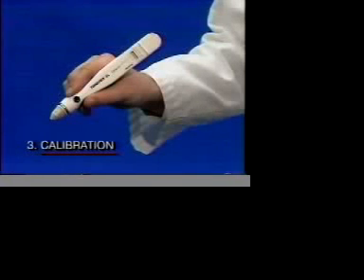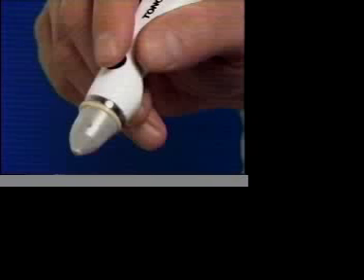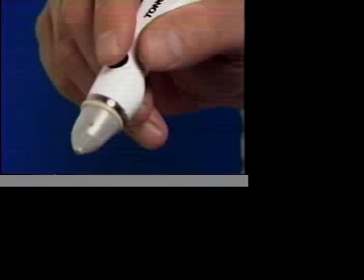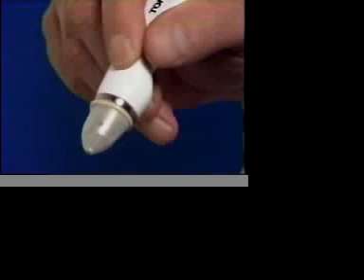That will help assure you that the instrument is measuring accurately. To check calibration, turn the TonoPen on by pressing the activation button for about half a second.